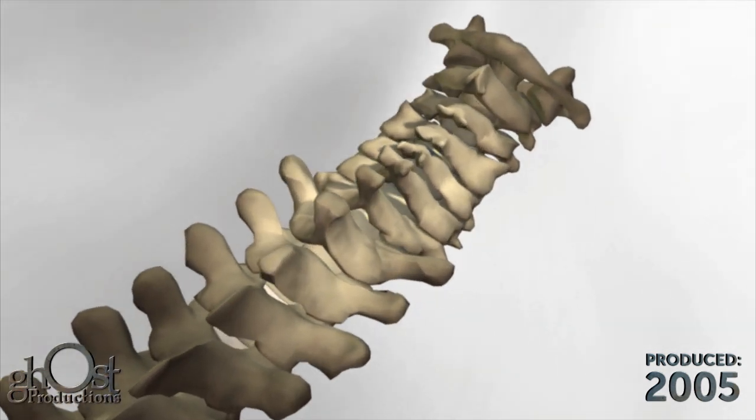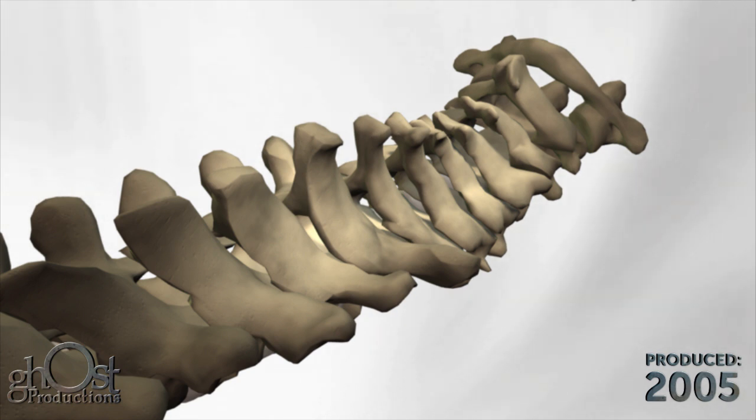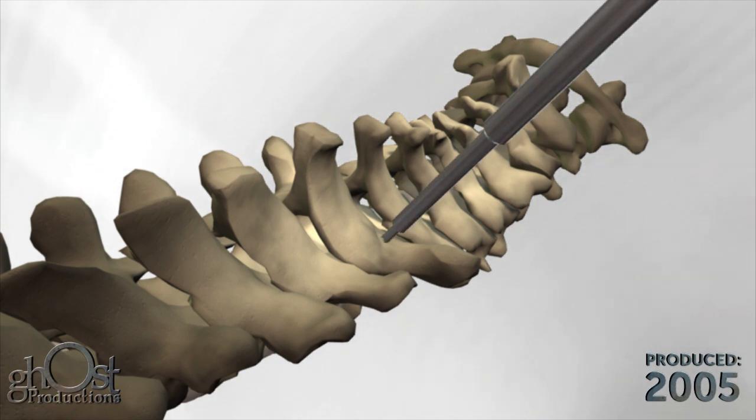Once the entry point and trajectory for the screw are determined, the awl is used to penetrate the cortical bone and create a starting hole.